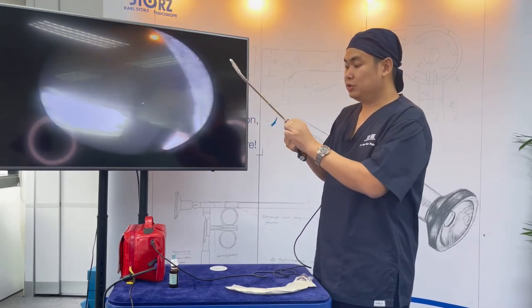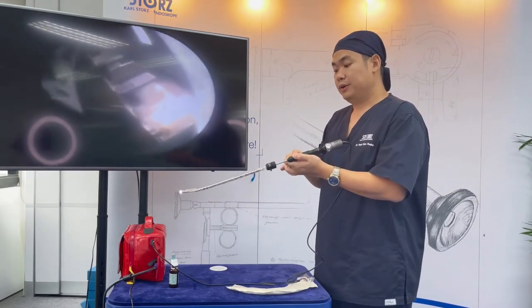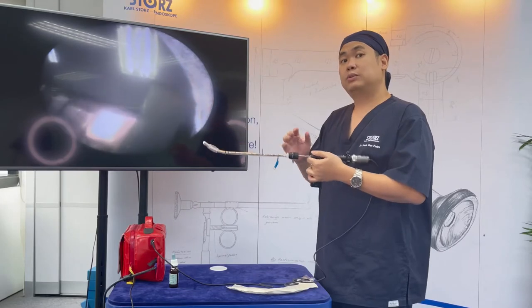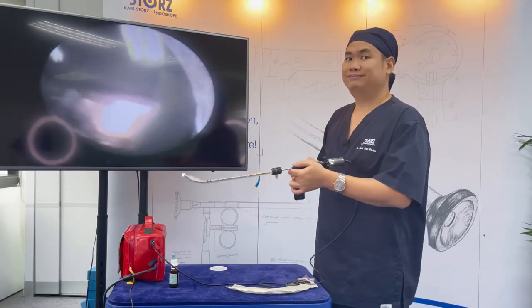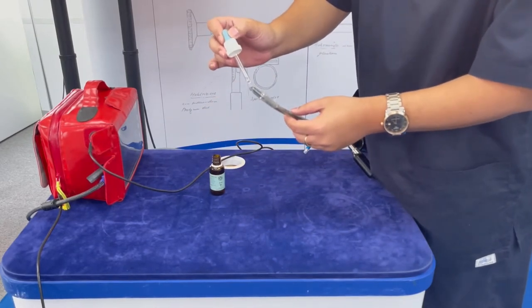Secure the ET tube with an ET tube holder. Here you can see an O2 port. If you're expecting the patient to desaturate, you could place O2 here so that it will serve as apneic oxygenation. This will also blow away secretions and blood away from your view. To prevent fogging, place anti-fog on the tip of the scope.